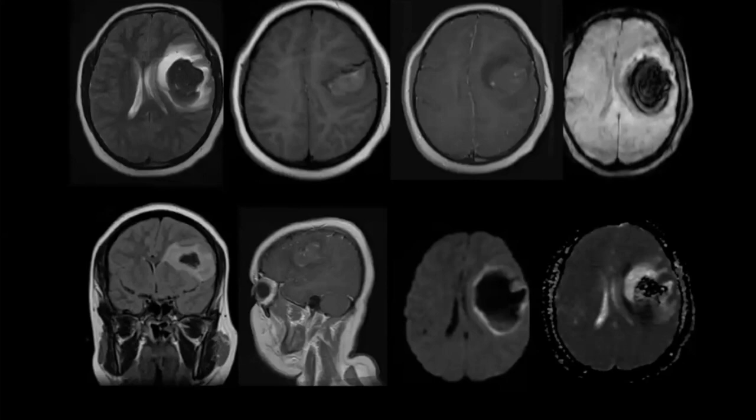Okay, so why will there be a spontaneous hematoma in a 15-year-old female? Do you want to work up more? Yes. I want to search for any aneurysm or any congenital anomaly of the cerebral vessels. So I would like to see an MRA. For the patient, I would suggest MRI or CT.